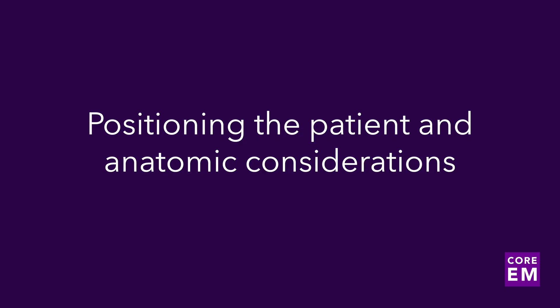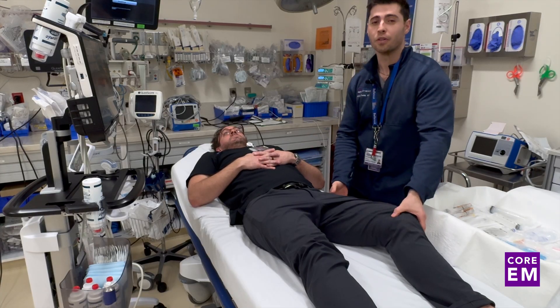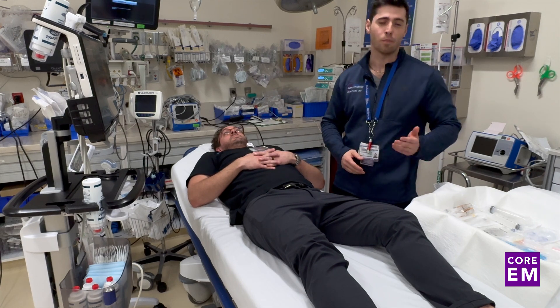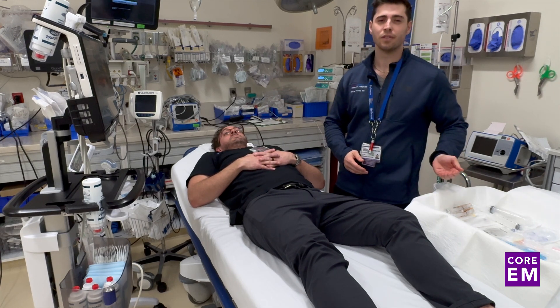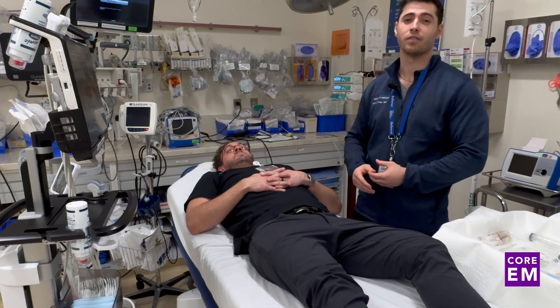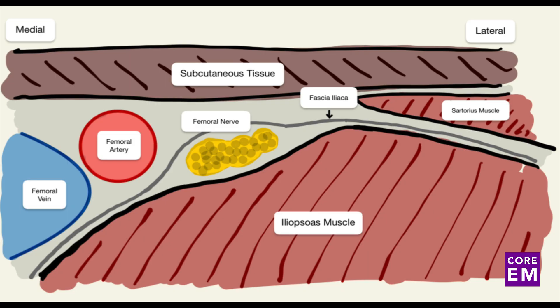So now let's get into positioning the patient and anatomic considerations for the procedure. You'd like to have your patient supine with their legs slightly externally rotated, with the ultrasound on the other side of the operator and your Mayo stand next to you for all your materials. With the patient positioned appropriately, you'll place the ultrasound probe along the patient's inguinal crease, and the operator is going to identify the femoral artery and the femoral vein.